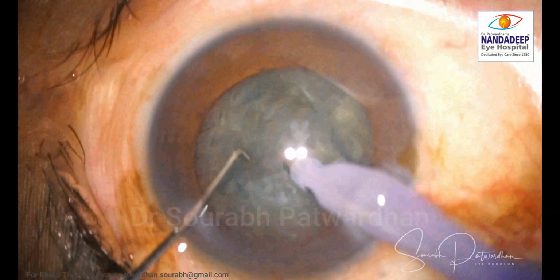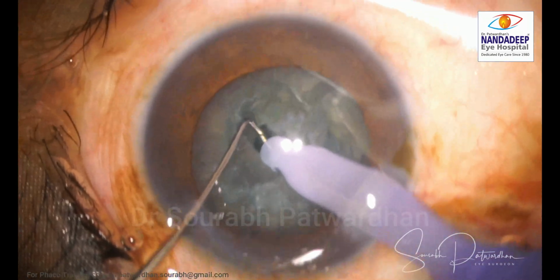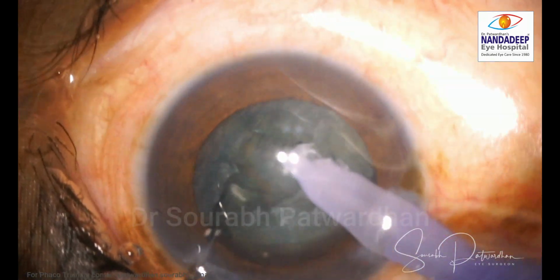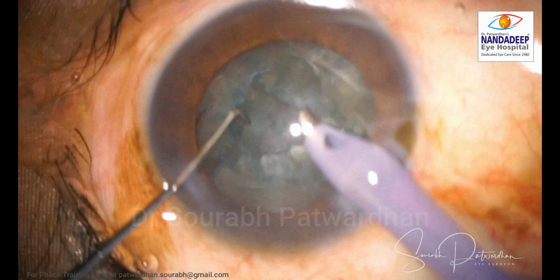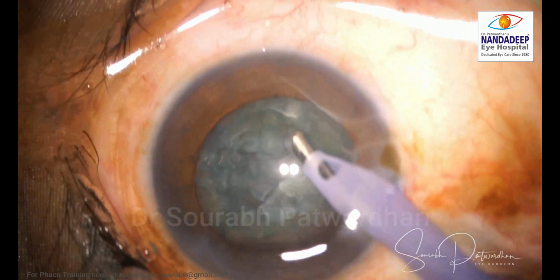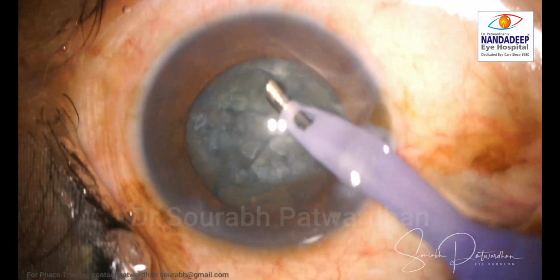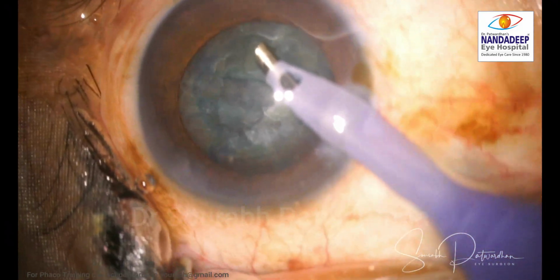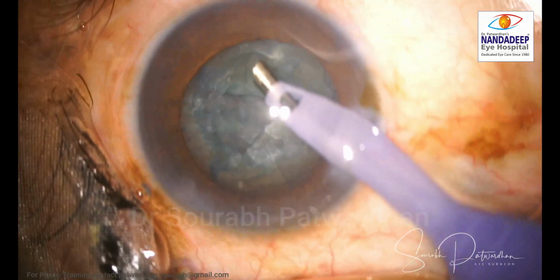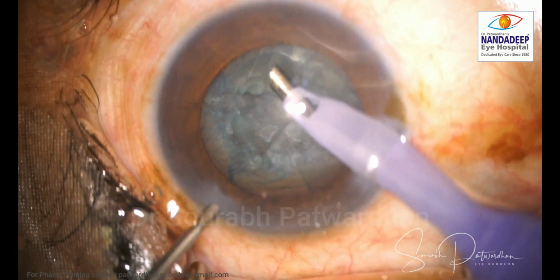This indicates that there is a posterior capsular dehiscence with the nucleus now tilting over the anterior hyaloid, and there is a nucleus drop possible now. And now I could feel that nucleus was going on one side here, so definitely there is a posterior capsular dehiscence there. So I inflated the anterior chamber again with the OVD while I removed the phaco probe.